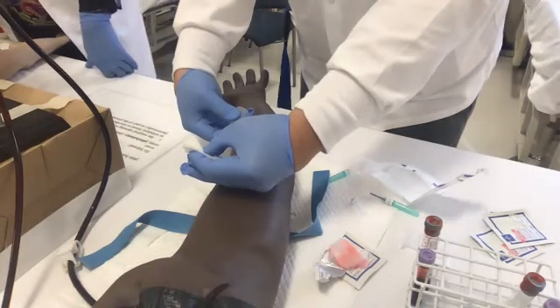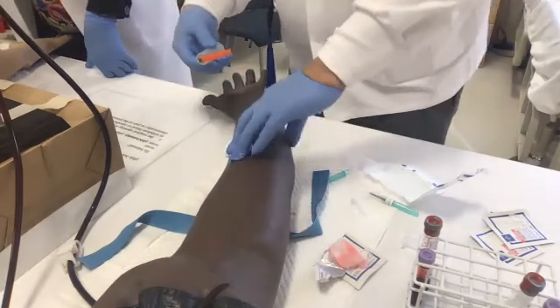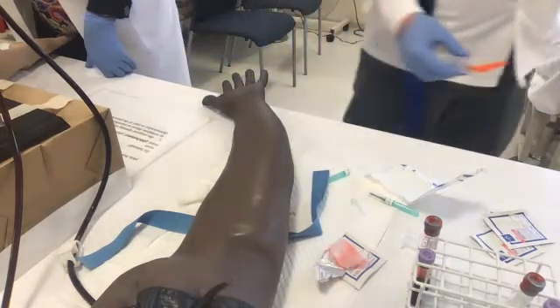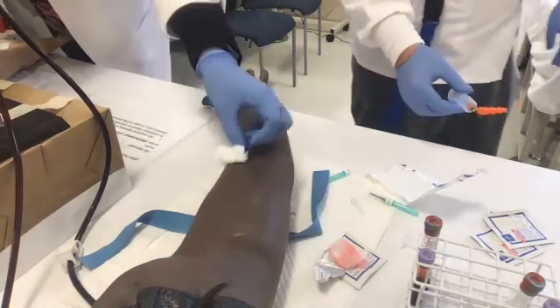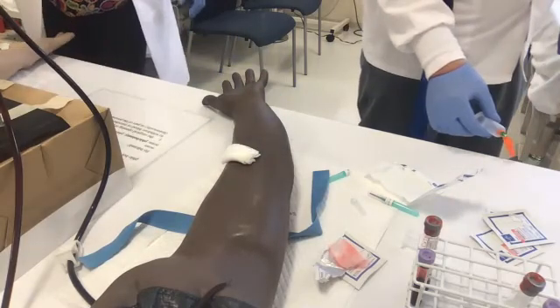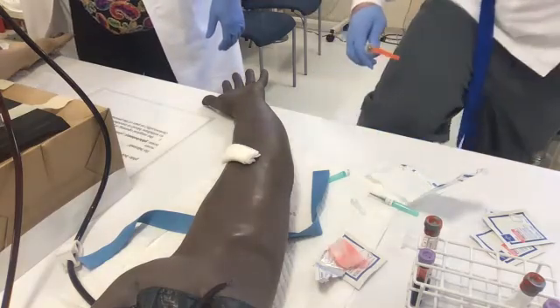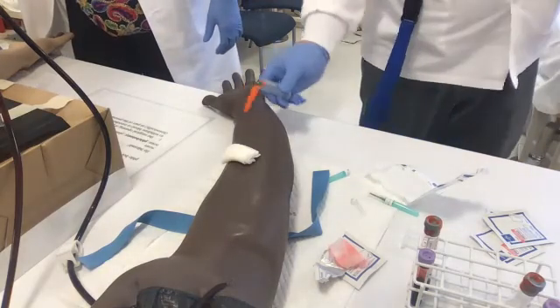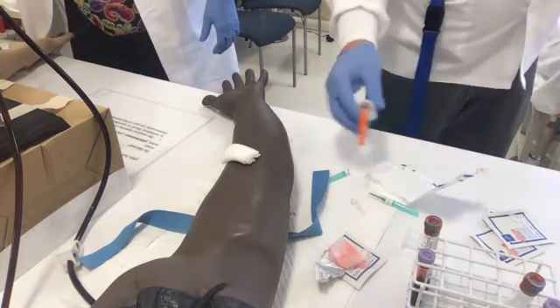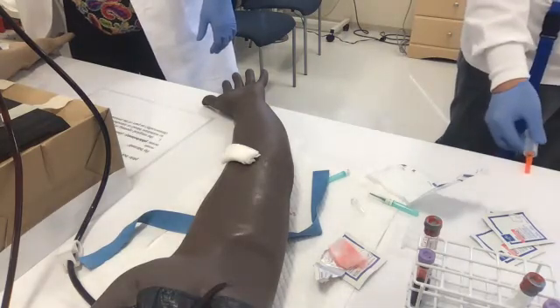Mr. Brown, we're almost done. And watch, I'll do it slow. Out, down. Mr. Brown, can you hold this for me, please? And he'll hold it. Then I walk away from Mr. Brown. I find a hard surface away from my patient. You don't do it like this. You don't do it like this, right? You don't do it like this. And I've seen all of it. You find a hard surface away from your patient. I step away, right? Click.